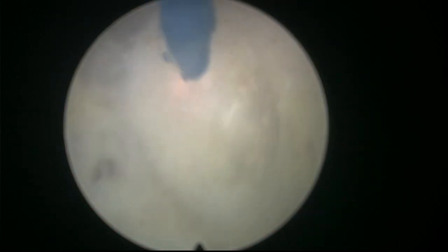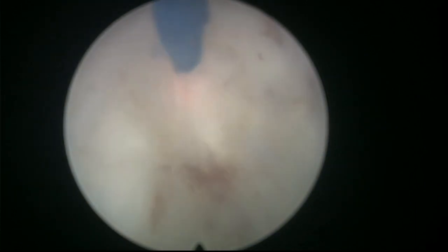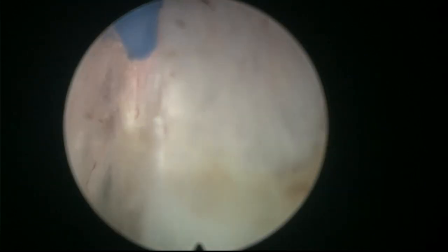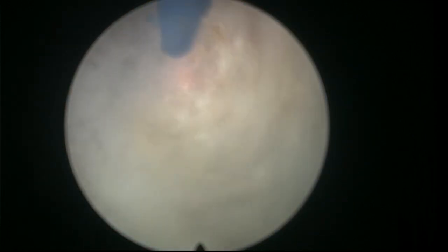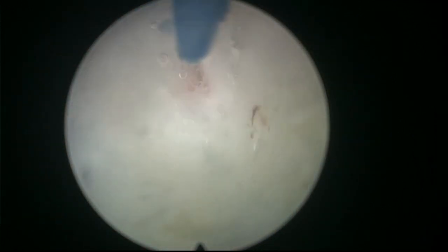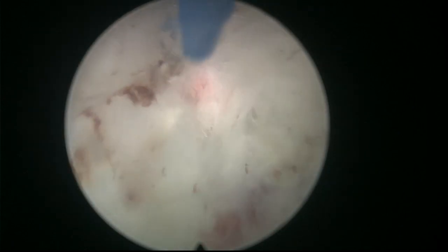Of course, I thought this was a definite advantage, and I thought that you could only do that with side-firing fiber. But then, learning HoLEP, because I thought if you want to be a good expert, you need to use different energy sources and get to know more, I started doing HoLEP, and then I thought, maybe I can do the en bloc approach as well.